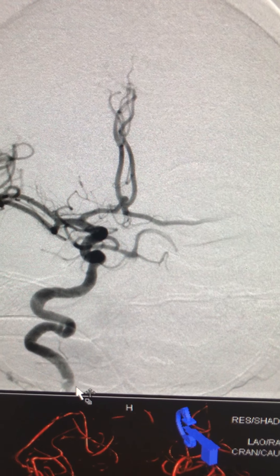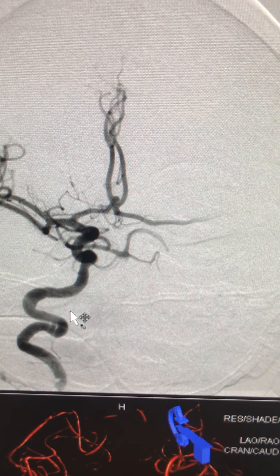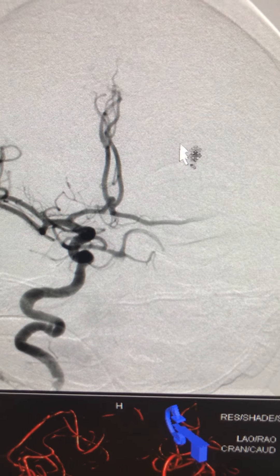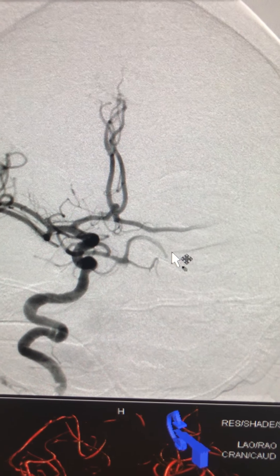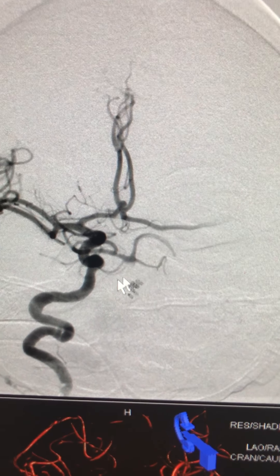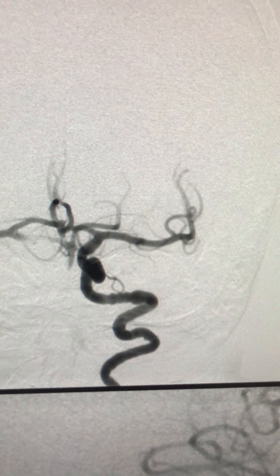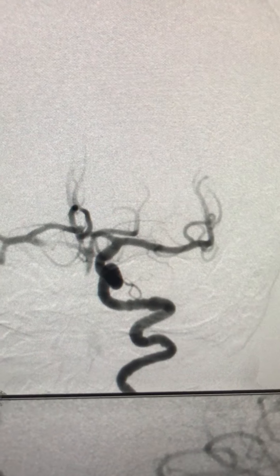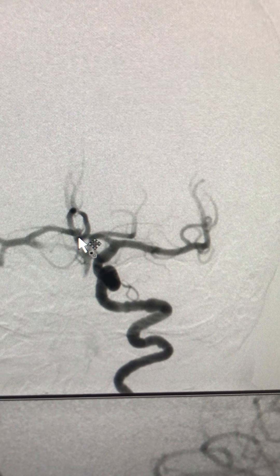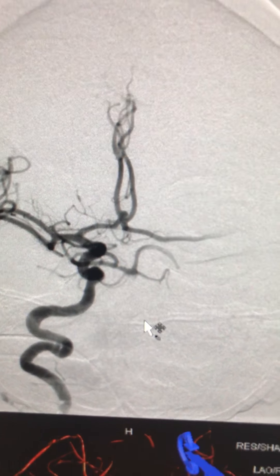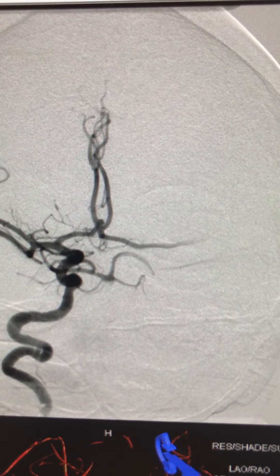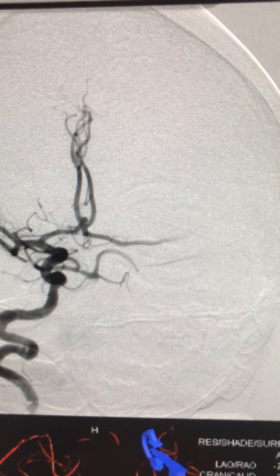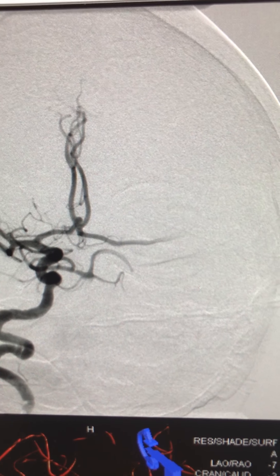It's a very small aneurysm with a reasonably wide neck. She has a lot of tortuosity in her vessels — cervical internal carotid artery as well as the petrous internal carotid artery. This is the angiogram with right internal carotid artery injection and left side as well. You can see it's a sidewall-type aneurysm, more on the right side.